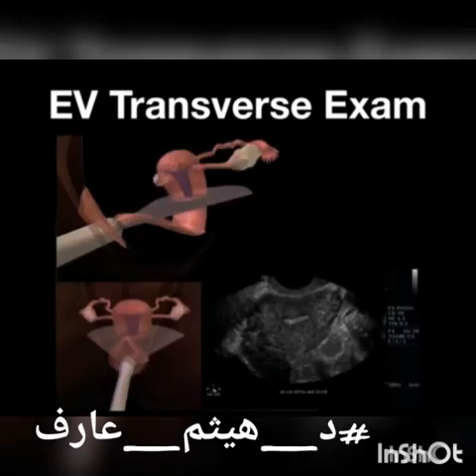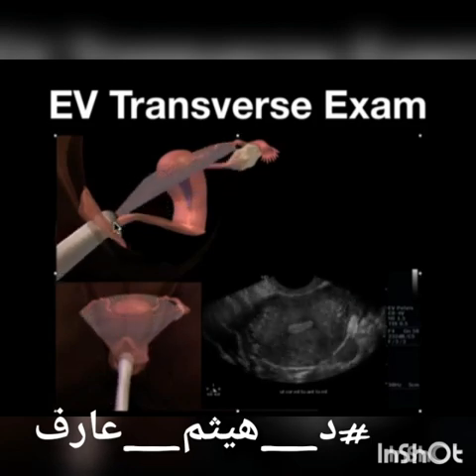When we look at the endovaginal transverse exam, again, you're going to have to sweep in order to evaluate the uterus in its entirety. So when you're in the transverse plane with the indicator towards the 9 o'clock position or the patient's right thigh, you're going to end up bringing the handle up and then down in order to fully interrogate the uterus.